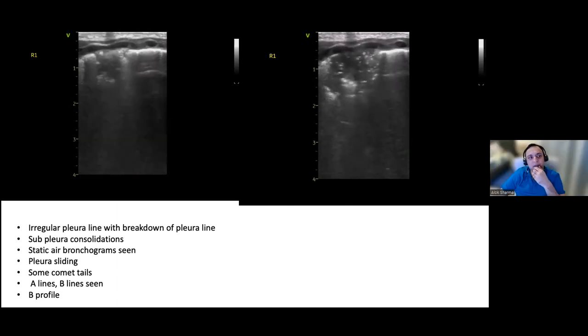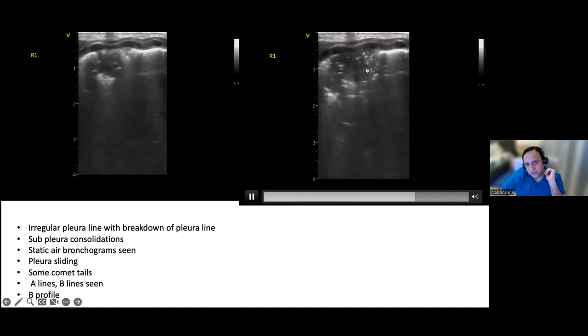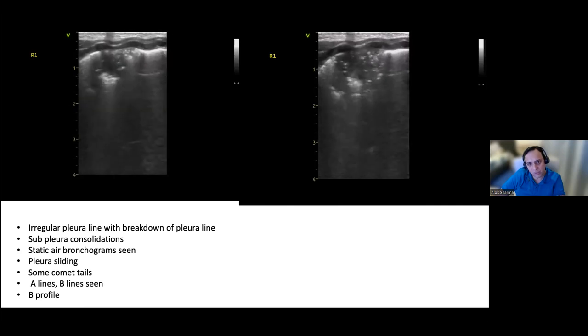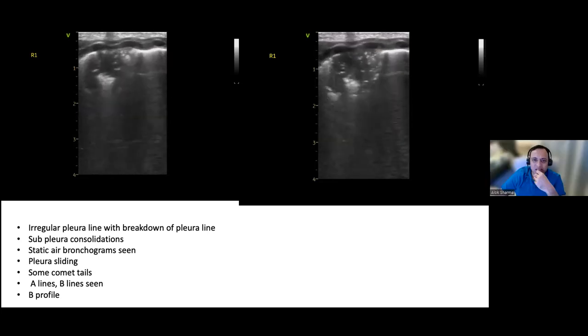But again, can you see how the pleural margin doesn't get established right to the top? So there's no aeration. There's aeration at the bottom, which is giving you that appearance of, like when you look at R1, the static air bronchogram appears and disappears with inspiration, expiration. And you have a predominantly AIS kind of pattern below that. Again, what I'd say is you've got a very large area of subpleural consolidation with atelectasis, but now you have very irregular margins.